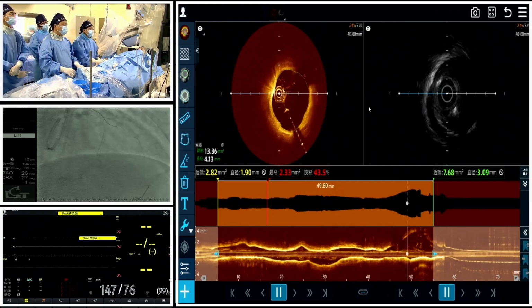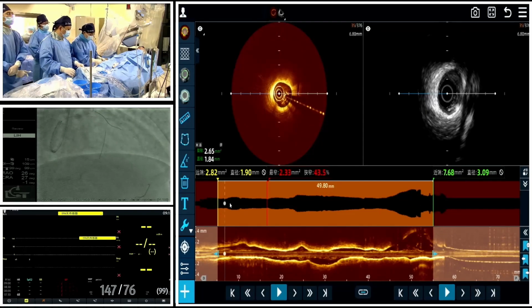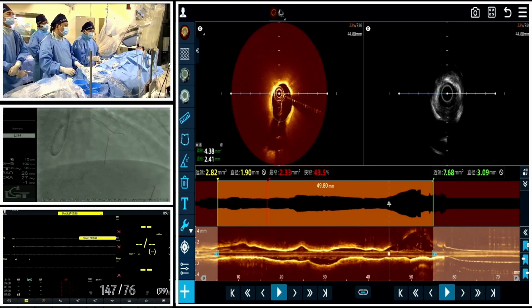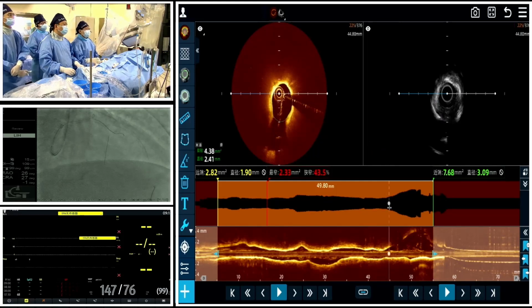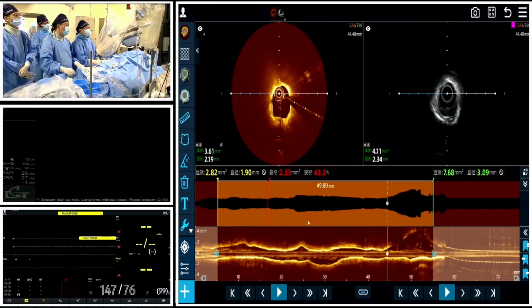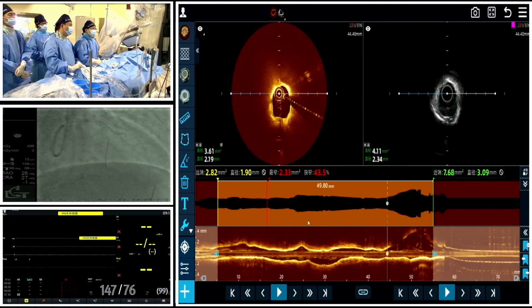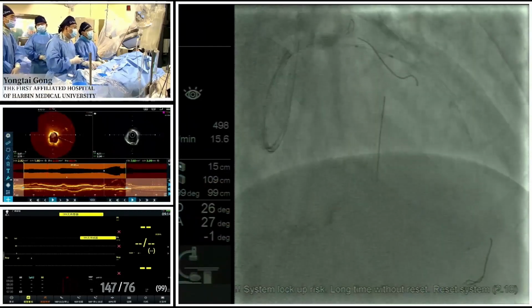All right. So for this lesion, I think you prefer to use one stent, right? Yes, a crossover strategy, but this patient has a long lesion, and this may need the middle segment of the LAD to the left main body. All right. Because from the imaging results, we can see there's some stenosis in the proximal circumflex. So, Dr. Zhang, why not choose that strategy?